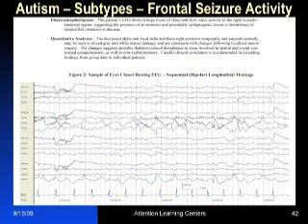This is one example of many that looks at seizure patterns. You want to see the brain waves like this. Each of these lines are 19 electrodes, or each one is where one of the EEGs comes from. And you see where all these lines run into each other here? That is seizure activity, where there's a discharge going on. It could be just in one location. If it's in the left hemisphere, it might interfere with language, or it could be everywhere, like the boy on the video who had an absent seizure, kind of had it everywhere.